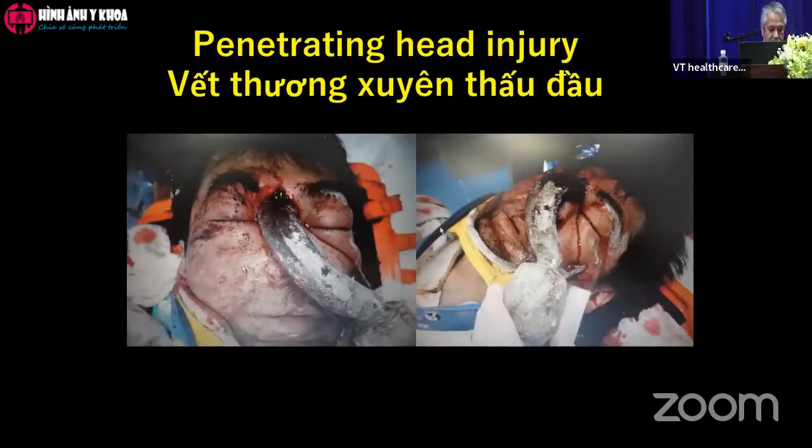Penetrating trauma caused by metal pieces is a situation where damage is not clear due to occurrence of metal artifact in CT. But in 3D, the position of the metal piece can be confirmed by creating metal pieces and bone.